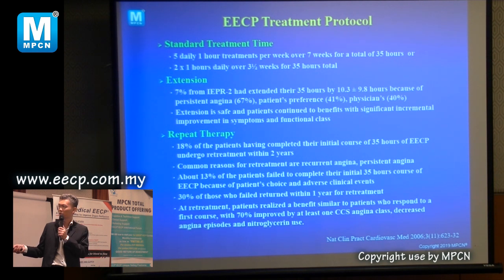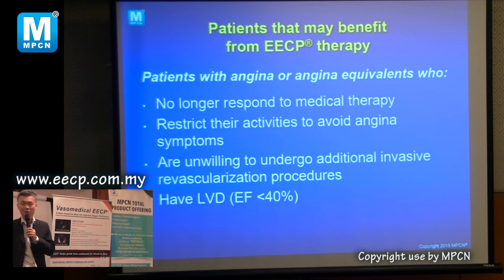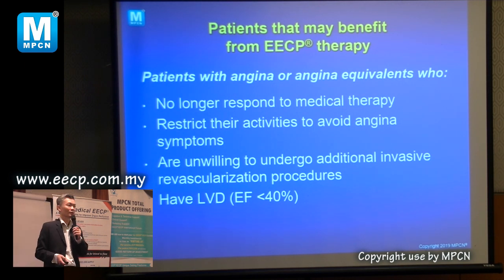Okay. So a common reason for repeating the procedure is that they continue to have chest pain. So how come some of these patients continue to have pain, but they still come to you? You have to be careful. So who will benefit from this?